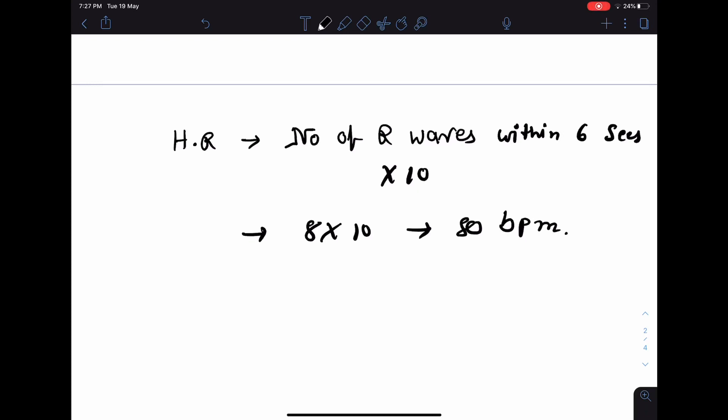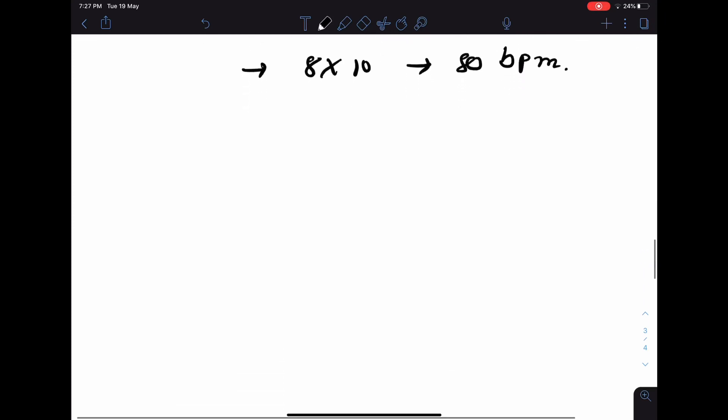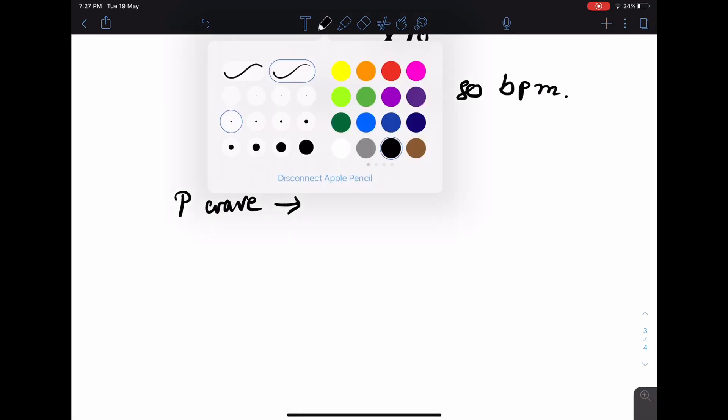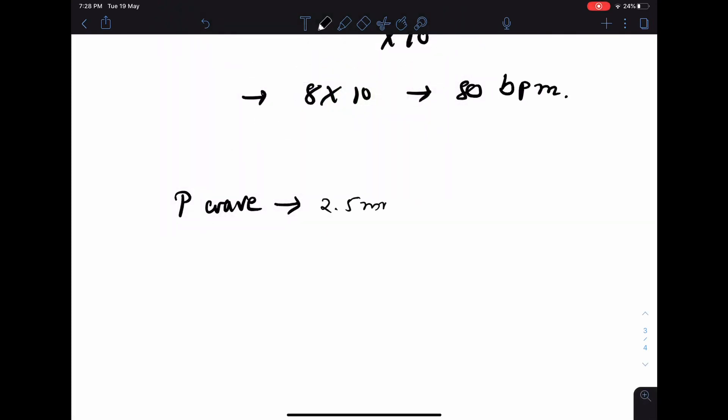So after commenting on heart rate and the rhythm, now we should be commenting on each waves and segments. P wave: the normal duration of P wave is 2.5 mm, that is up to 0.1 second. That is actually the maximum duration of P wave. The maximum amplitude of P wave is also 2.5 mm.